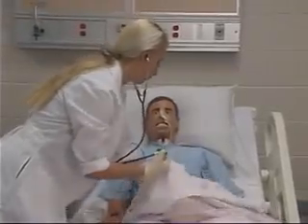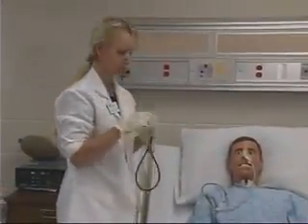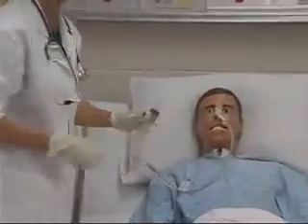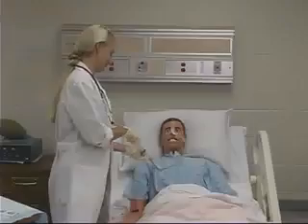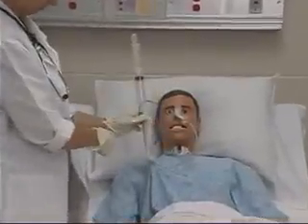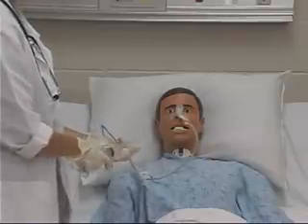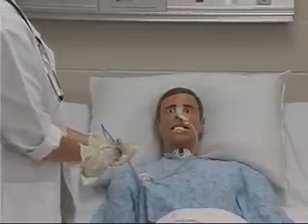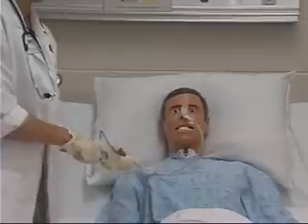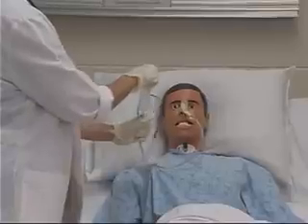Determine the position of the NG tube using sounds with a stethoscope and aspiration of gastric contents. Aspirate the gastric contents to determine residual volume. If residual volume is greater than one half of the volume previously delivered, hold the feeding and recheck in one hour. Return aspirated contents to the stomach, as these secretions contain electrolytes and their return helps prevent electrolyte imbalance.